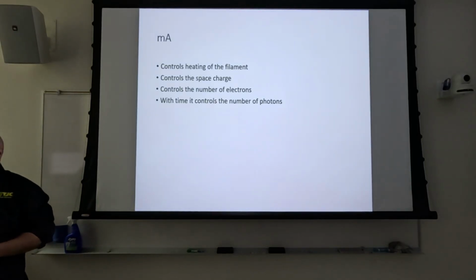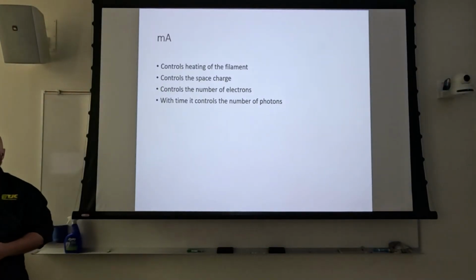That focusing cup can fail. So let's say you got a tube that's clicking along real well, right? And you walk into the room one day and you make an exposure and it comes up and it's like, this is just garbage. So you repeat it and it says, yep, this is garbage again. And every exam that you shoot in there, everything is fuzzy. Then likely what happened is you lost your charge at the focusing cup. It's going to be more dramatic and immediate than something like warping of the anode or anything on the anode that potentially could cause a loss of sharpness or recorded detail.